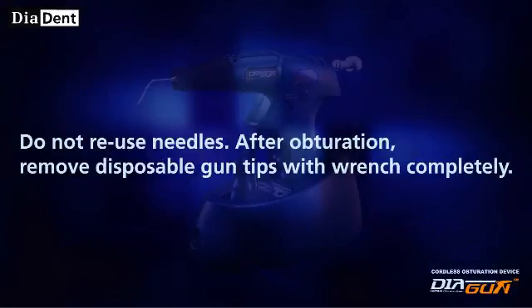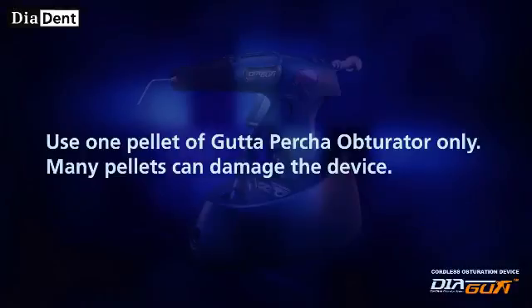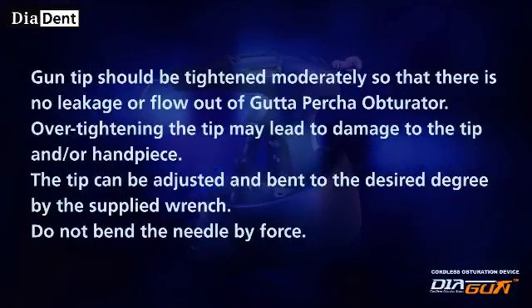After obturation, remove disposable gun tips completely with the wrench. After each use, remove all visible soil from the Gutta Percha obturator in the heat chamber with the scrubbing brush. Melt the residual at 160 degrees Celsius and clean it all. Use one pellet of Gutta Percha obturator only — multiple pellets can damage the device. To reduce injury to the patient or operator, always place the safety cap on during use. Gun tips should be tightened moderately so that there is no leakage or flow-out of Gutta Percha obturator.